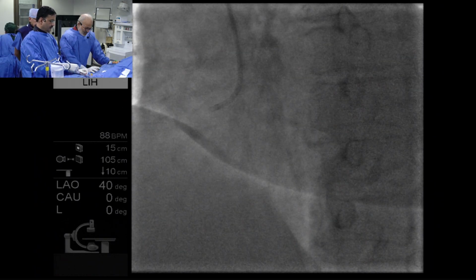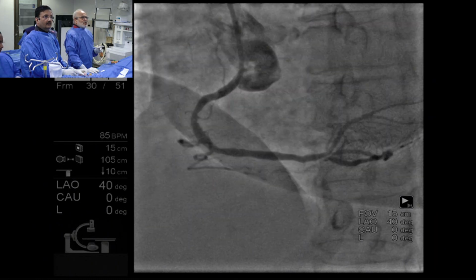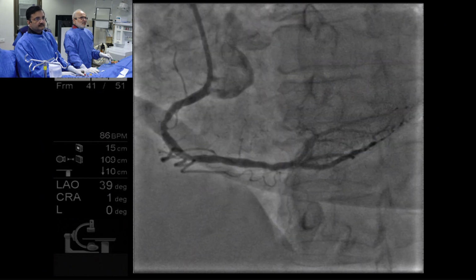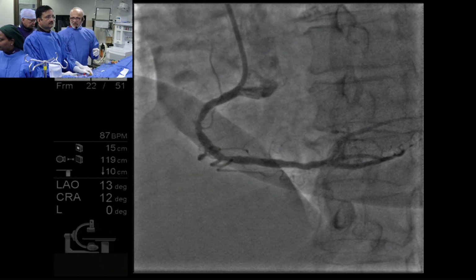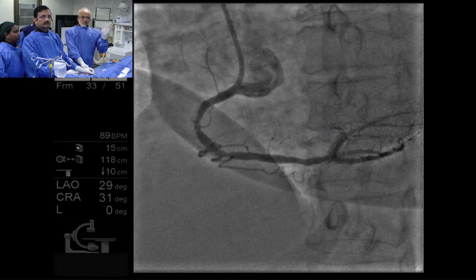And now you see, Rajiv, again, let us presume. What do you think about the proximal? Go to the proximal lesion. How will it look in OCT? And how will it look in IVUS? Let us go retrograde.